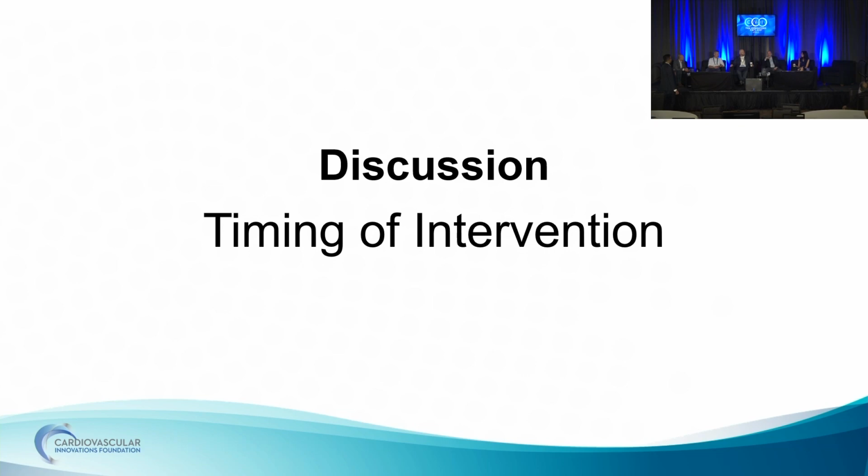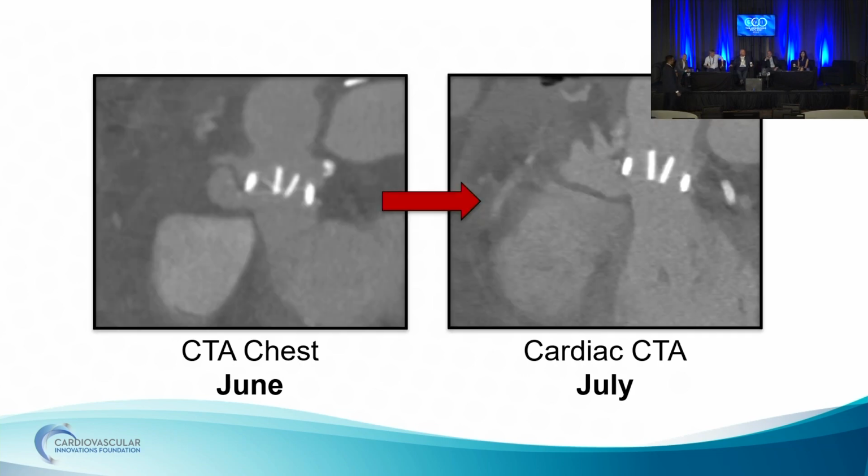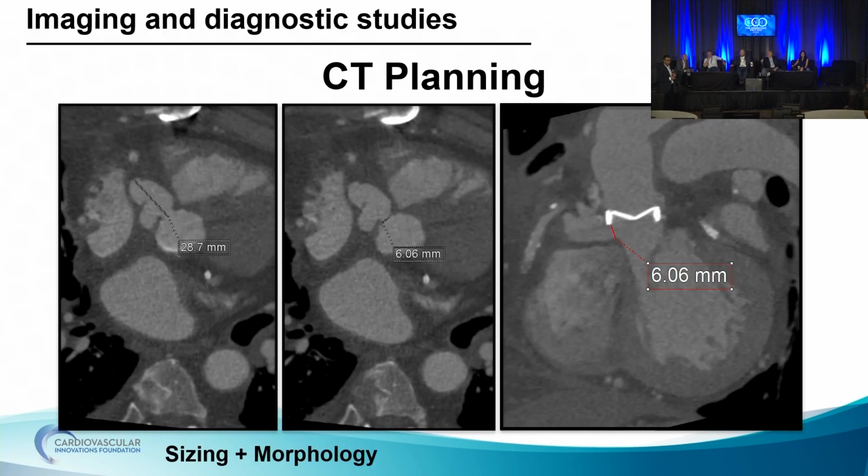Yeah, I agree with all that. Can you go back just to show? Yeah. And I have some more images too, to show you the surrounding structures so that we can better understand it. You're going to need a multi-device approach here, probably. I don't think it'll be one or the other. Yeah, absolutely. So where's the entrance? So it's the LVOT. Yeah, absolutely. Let me go on to the next images to show.